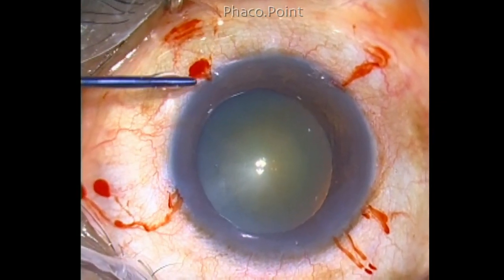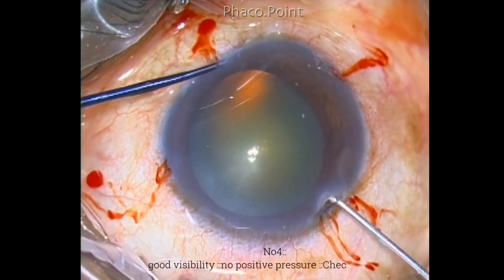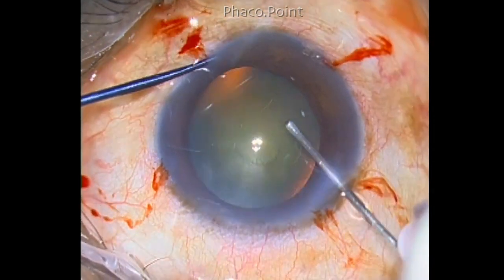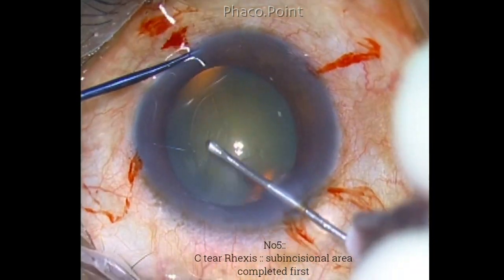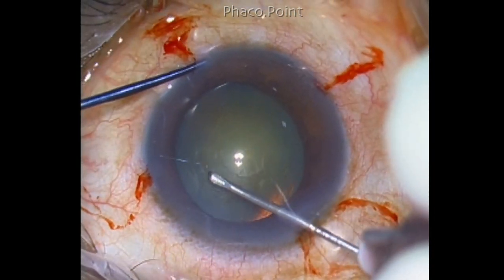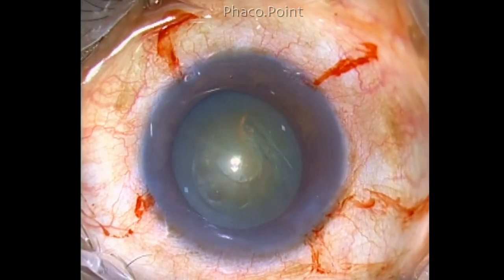Ensure that you have very good visibility, a well-formed anterior chamber, no positive pressure, and that the speculum is not too tight on the eye before you start with the capsulorhexis. I like to start the capsulorhexis at the nine o'clock position and finish the sub-incisional area first by creating a C-tear. This will enable me to finish the capsulorhexis without folds of the anterior capsule slipping out of the clear corneal incision.